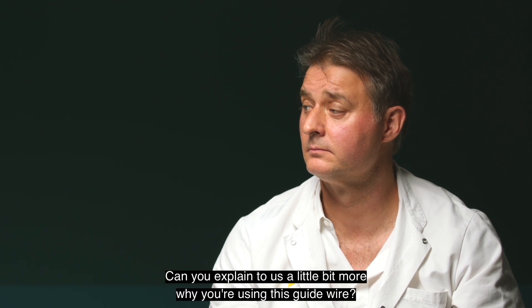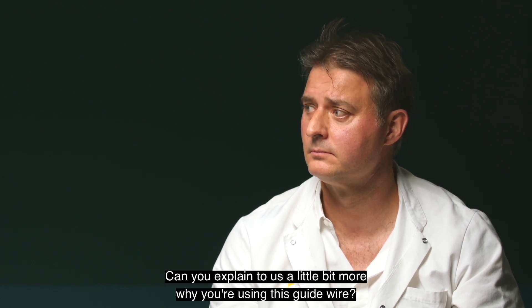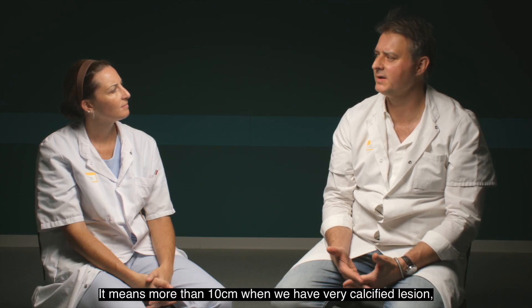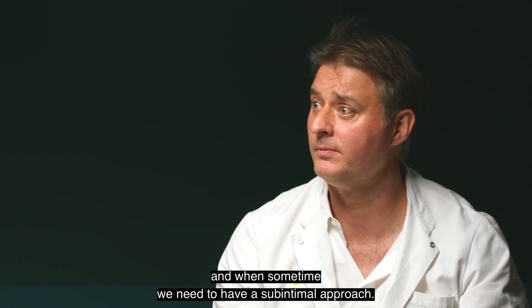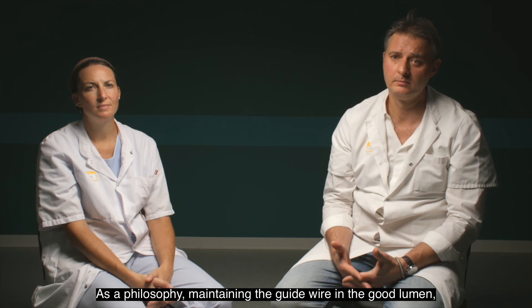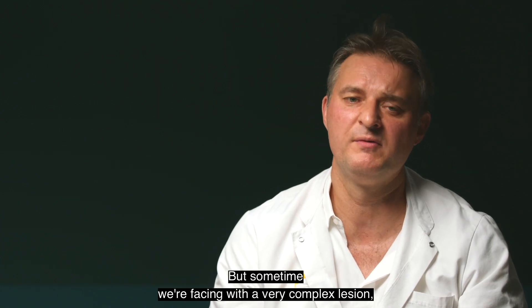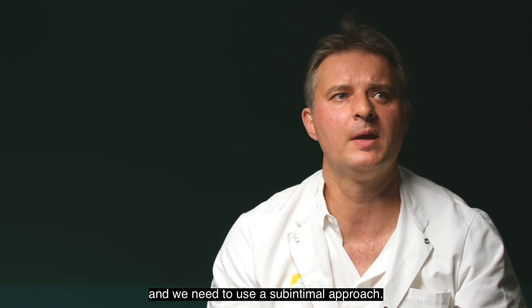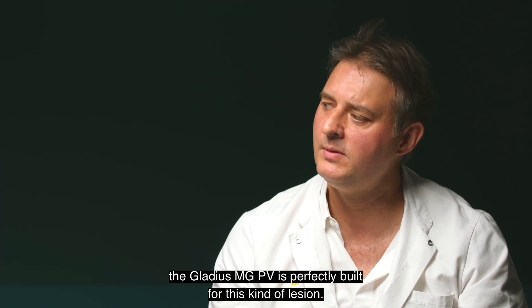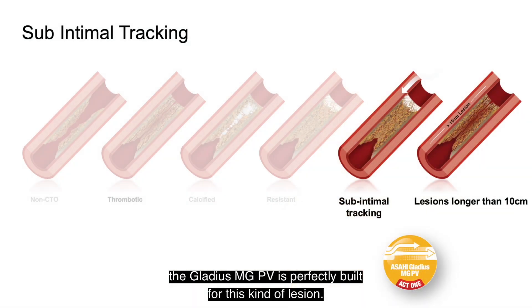I know that you're using another type of Gladius, the Gladius MGPV. Can you explain why you're using this guide wire? Indeed. I use the Gladius MGPV for very complex lesions — more than 10 centimeters, very calcified lesions, and when we sometimes need a sub-intimal approach. The philosophy of making a guide wire to stay in the true lumen perfectly matches my daily practice. But sometimes we face very complex lesions and need a sub-intimal approach, and the Gladius MGPV is perfectly built for this kind of lesion.